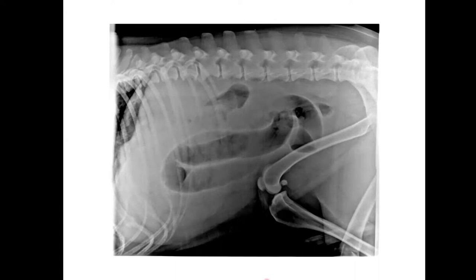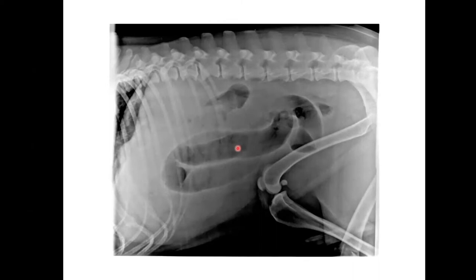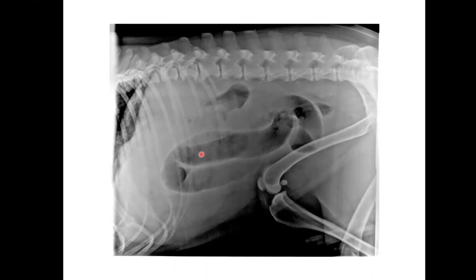I completely agree with all of your findings. There's this big gas-filled loop of bowel in the mid abdomen on the lateral view — eyeballing it, it certainly looks dilated. As you pointed out, the serosal detail here is really poor. Other than the gas within this dilated loop of bowel, we're not really able to see the margins of any other organs — not the liver, spleen, bladder, or kidneys. It's all just one uniform radiopacity. These aren't the greatest films in the world, but the fact that we have loss of peritoneal serosal detail and what looks like a dilated loop of small bowel should certainly be ringing alarm bells for this dog potentially having an obstruction, a mechanical ileus, and potentially a foreign body.